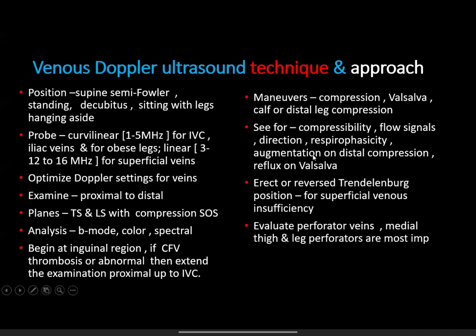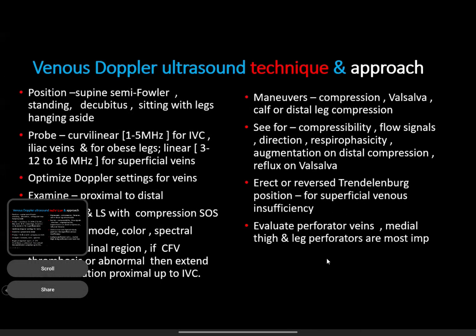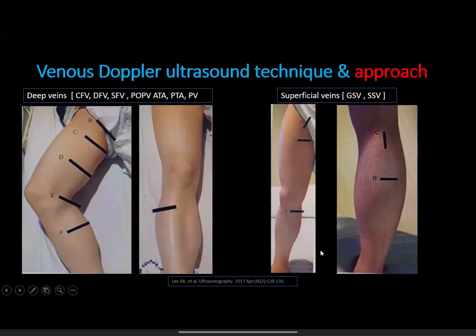And we should also evaluate the perforator veins in the medial thigh and leg. These are very important perforators. And we examine the patient in erect or reverse Trendelenburg position for superficial venous system insufficiency. So these are the technical points, and how we approach.